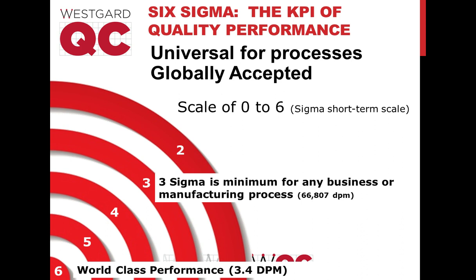That's great, and I think that is the new challenge. Now that we have the science of determining QC frequency, we have to match the mathematics that we can get for QC frequency with the practical reality of how tests are run. And certainly for something like the monocytes and the baso channel, the quality on some of those differential counts for a lot of different manufacturers is not as high as what you'd see on the RBC channel.